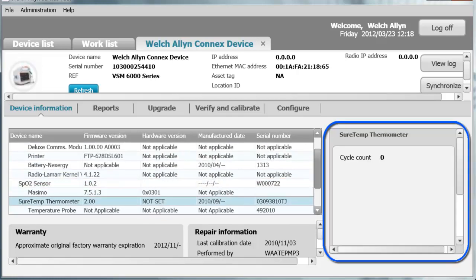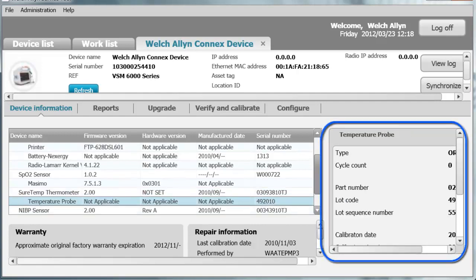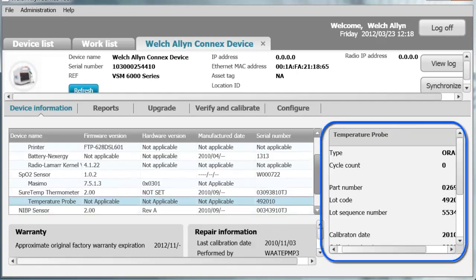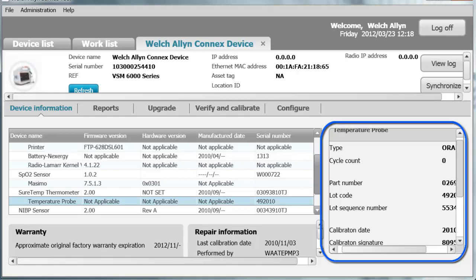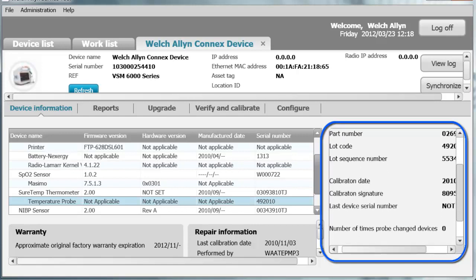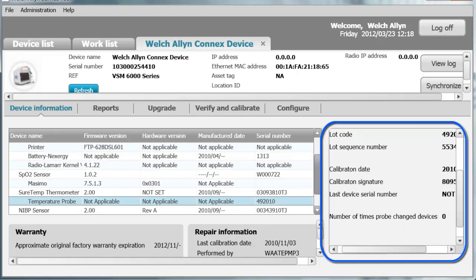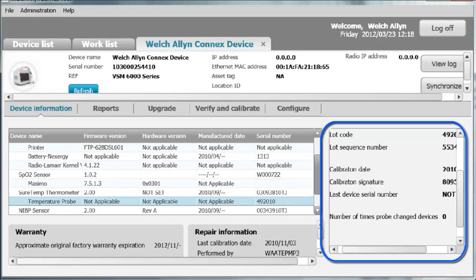The SureTemp thermometer — when you click on it, you can see the cycle count, indicating how many temperatures this module has taken. When you click on the probe, you can see the type of probe and the cycle count of the probe, which is the number of temperatures the probe has actually taken. You also see the part number, the lot code, the lot sequence number, the calibration date, who calibrated it, the last device this probe was used on, and the number of times this probe has changed devices.